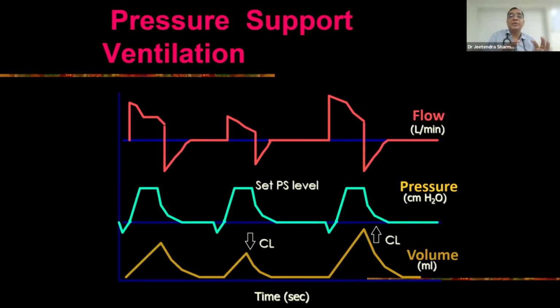If you are not around the patient, the same 30 pressure limit, which previously when you received the patient was producing a 300 tidal volume, over 2 or 3 hours, depending upon how good your treatment is, will give you a 500 tidal volume, 600 tidal volume, and more. The more the patient becomes better, this risk keeps on.